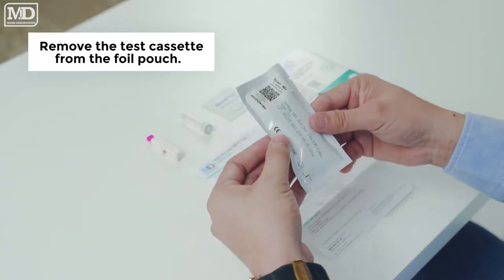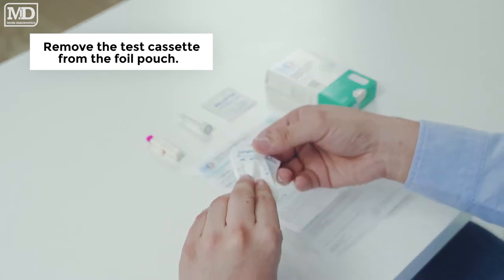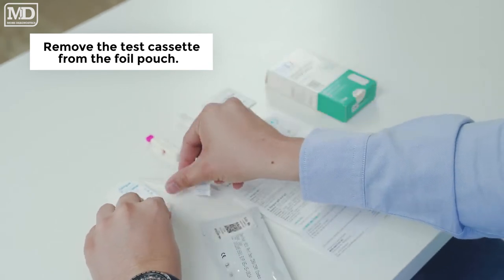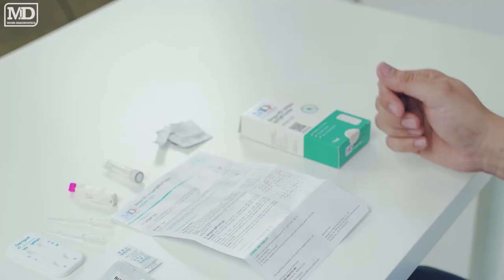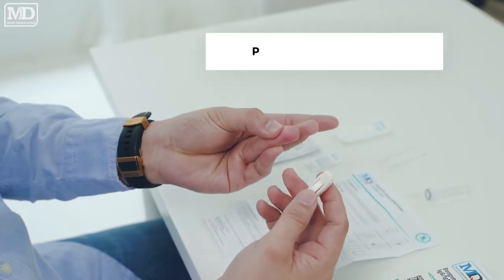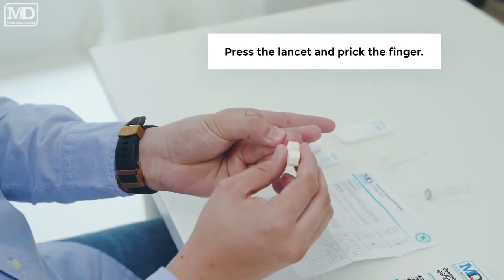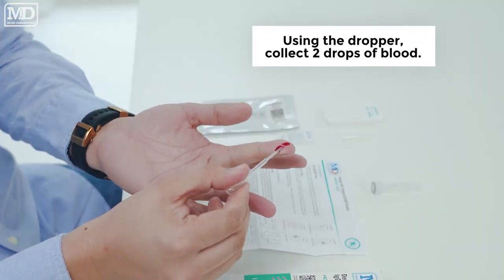Remove the test cassette from the foil pouch. Wipe your finger with the alcohol pad. Open the cover of the lancet and press the lancet to prick the finger. Using the dropper, collect two drops of blood.